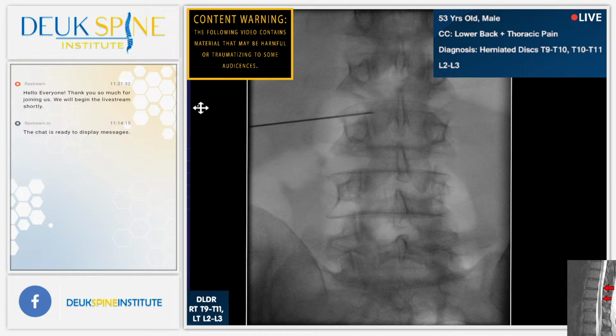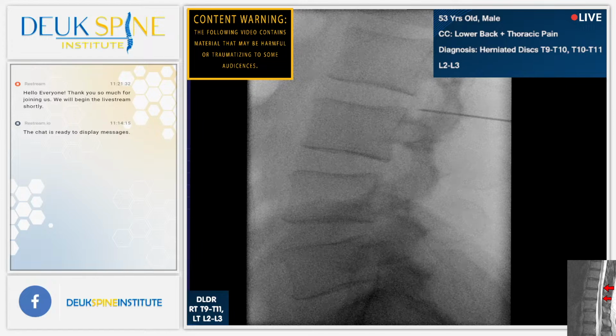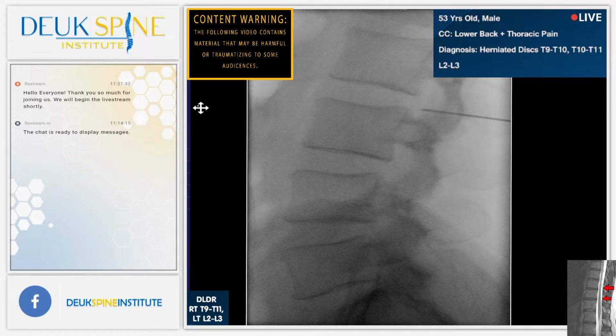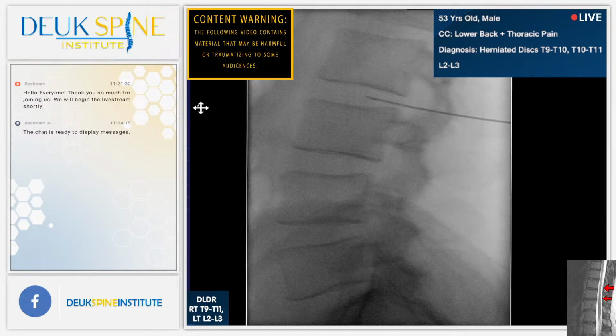So we're right at the disc in the back there. I want to adjust my trajectory just a little bit. Shot. Shot. All right. Shot. So this is the 2-3 disc. You can actually see the herniation right there. You see it, Jordan? Show us the herniation. See that curve right there? That is the herniation. And everyone agrees this is 5, 4, 3, 2, 2-3? Yes, sir. So we are treating 2-3. There is a tear there. I could feel it. All right, let's go down to the sacrum.